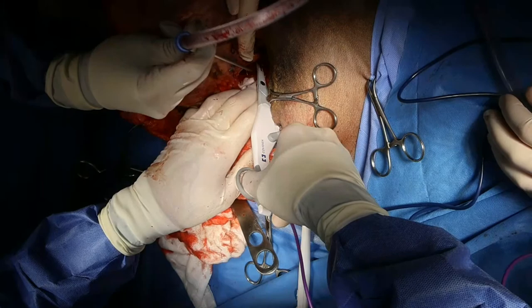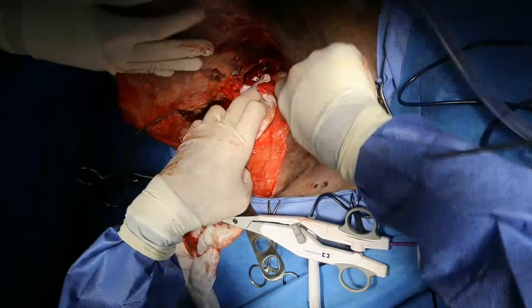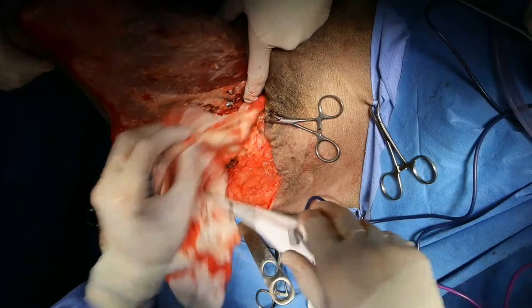Okay, so I'm right into my pelvic canal. I'm probably getting to my sciatic nerve right there. So I can see that. Can you guys see that sciatic nerve? I doubt you can see it on the live stream, especially with Alex's head in the way. All right, so we're just slowly and carefully making our way around.